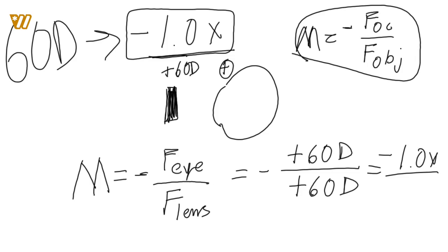Now, what you guys also need to remember is that whenever we're doing fundus lenses, we're also having a slit lamp here. So we have a slit lamp that we're looking through, and that's going to create magnification. So the overall system of you looking at the patient, you're going to get magnification because the slit lamp is going to create magnification.